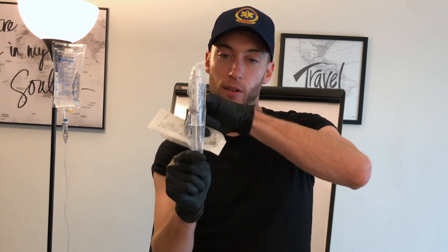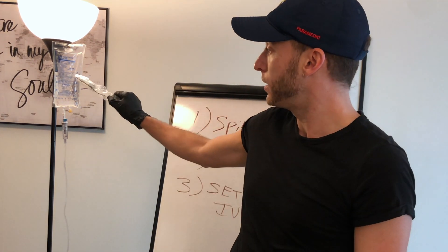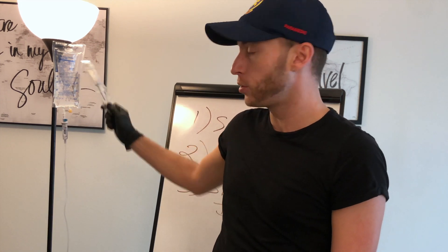You have your IV lock, and you have your flush — normal saline right here. This is going to flush out the IV line and make sure it's patent. This is for giving fluids or meds to a patient.